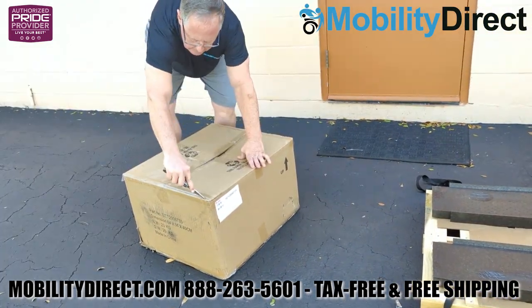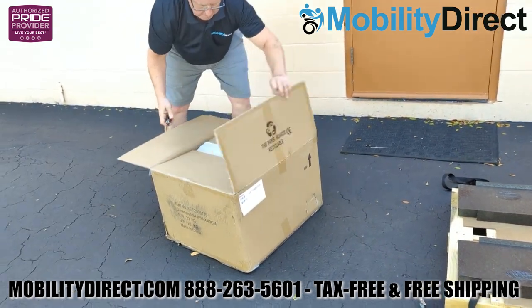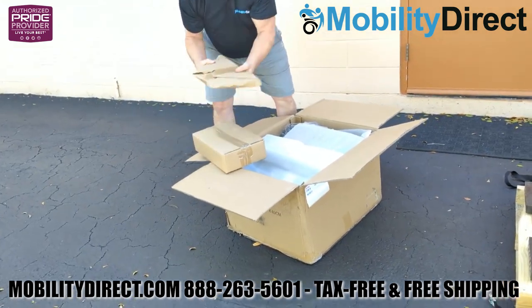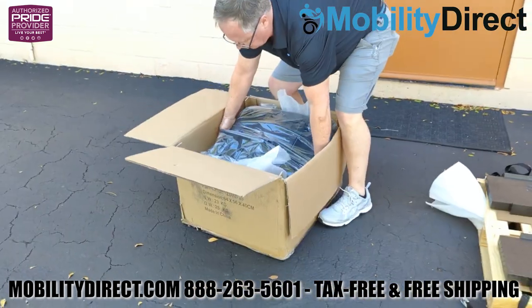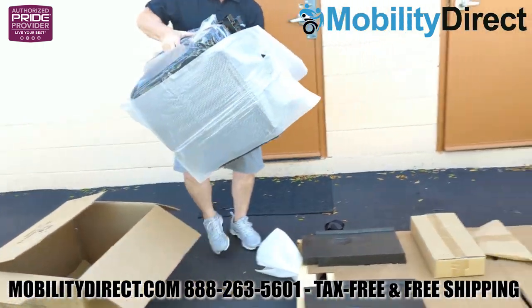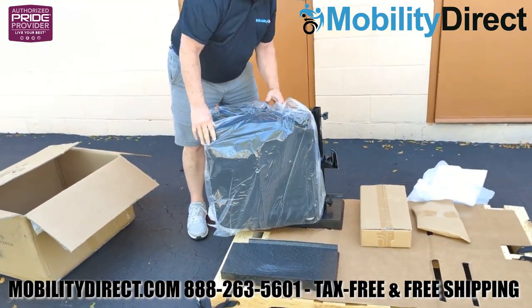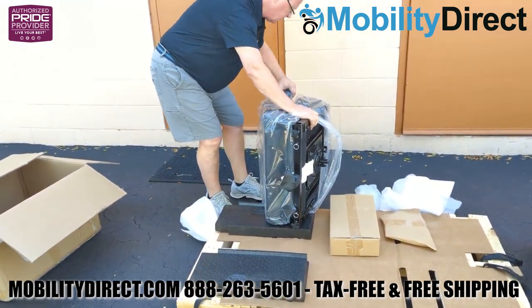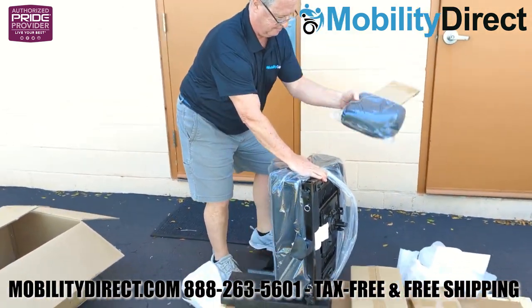Now we're going to go ahead and take the seat out of the box. It does come with a captain's seat with height adjustable and width adjustable armrests that also flip up. You can also rotate the seat, and it does have a semi-reclined feature as well as a height adjustable headrest. Go ahead and get the seat out of the box and unwrap it — there's going to be a lot of Styrofoam and plastic sheeting. You'll find the headrest sandwiched between the bottom part of the seat and the backrest, which you will need to unpackage as well.